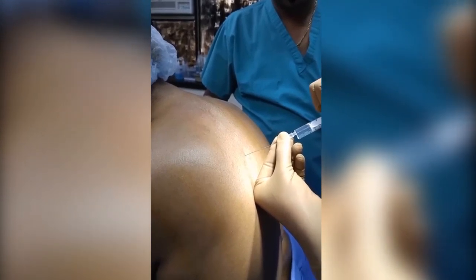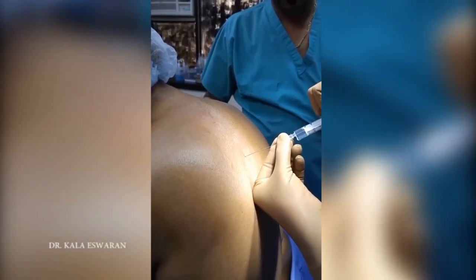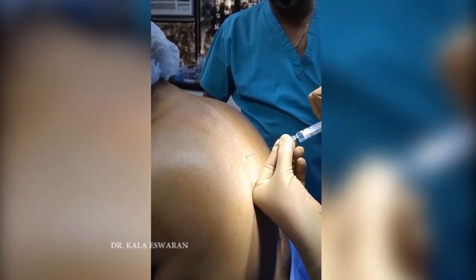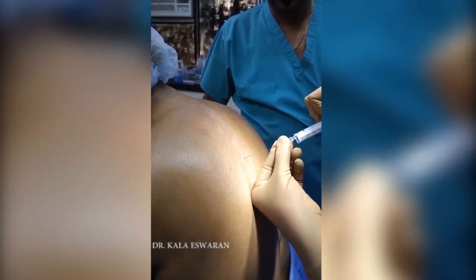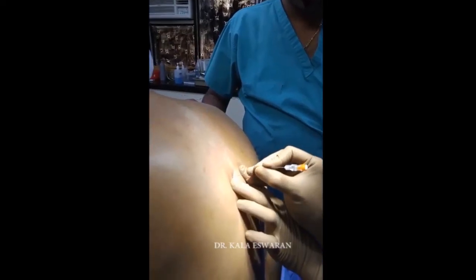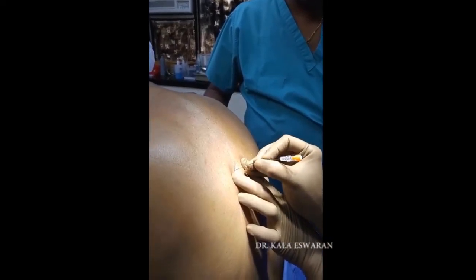In right-sided blocks, you can keep the thumb of the left hand on the superior aspect of the spinous process, and there is no crossing over of the hands as there is in left-sided blocks.